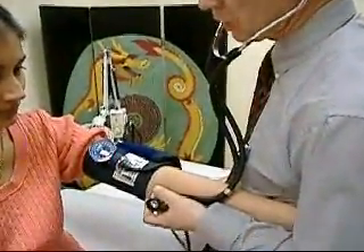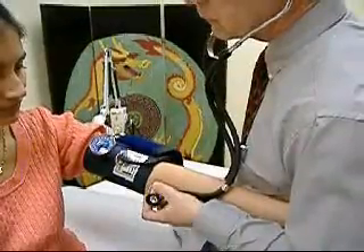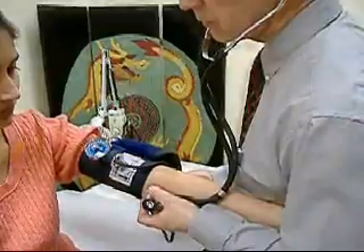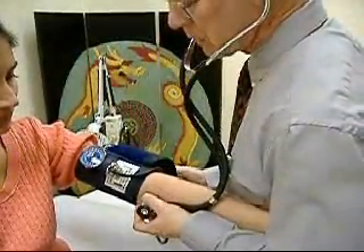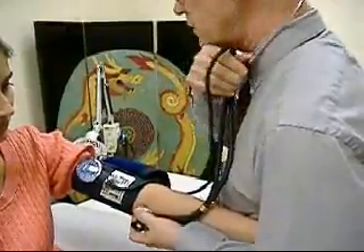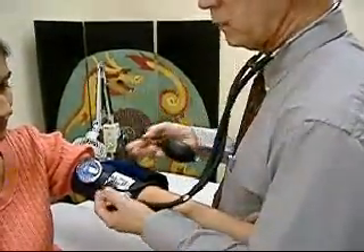You hold the person's arm, pump to about 160, open the valve and listen. 96 over 60. What you're listening for is the first sharp tap, and then when the sound changes or muffles.